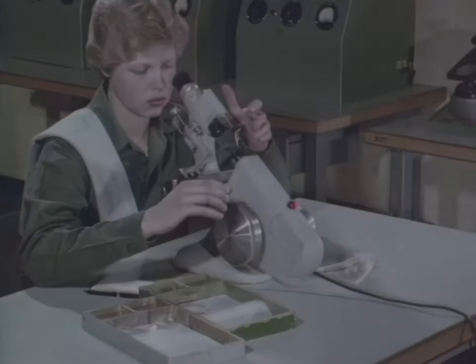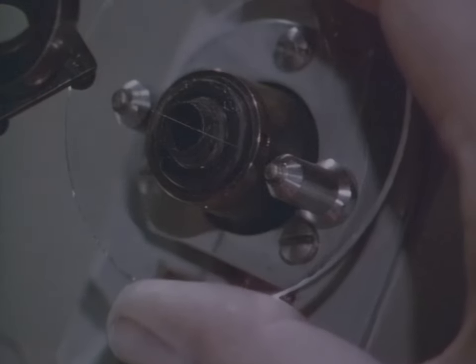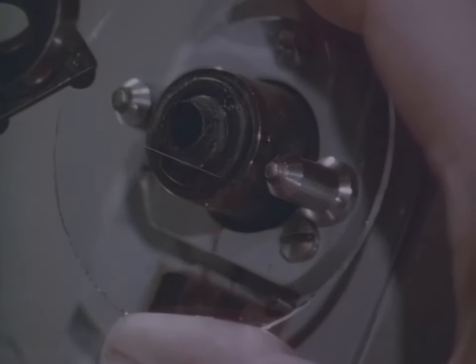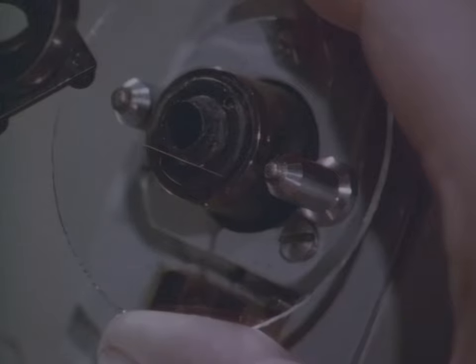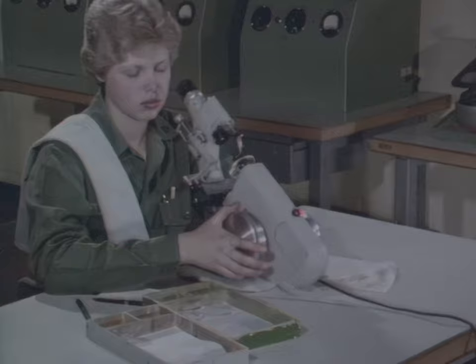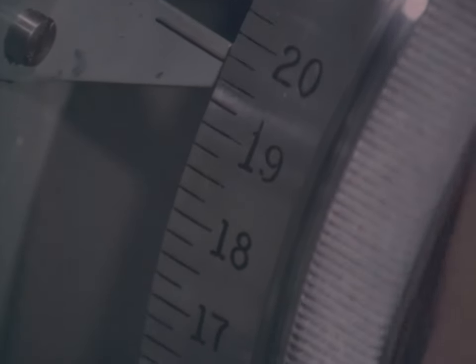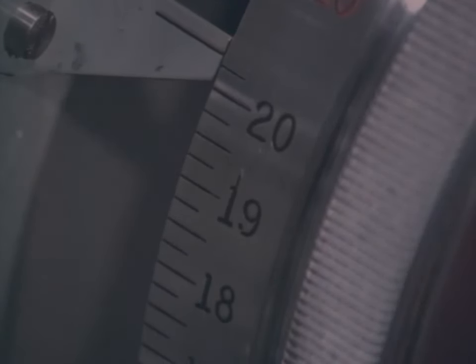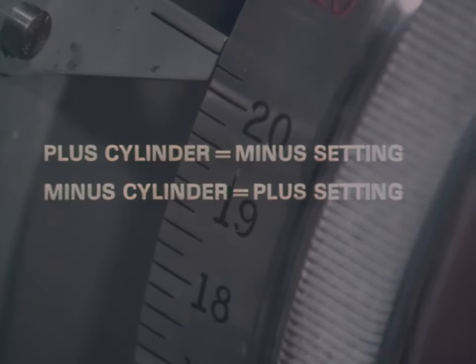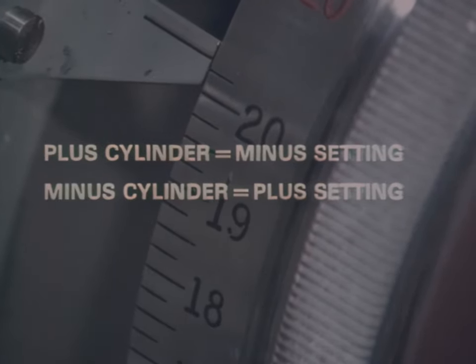The next lens we'll do is a bifocal. Mount it with the bifocal segment at the bottom and below the lens tube so you are looking through the lens itself, not the segment. Convex side is toward you as usual. With bifocals, you always work in minus cylinder form, so you start with the power wheel turned to the full plus setting. Think opposites: plus cylinder, use a minus setting; minus cylinder, use a plus setting.